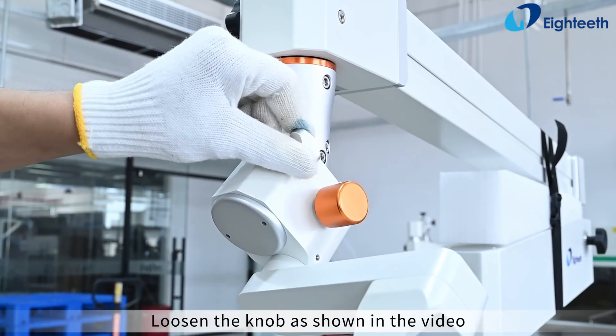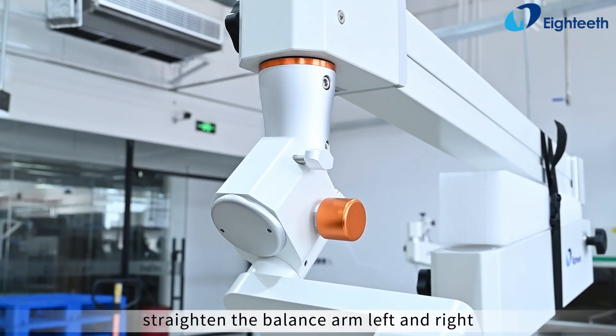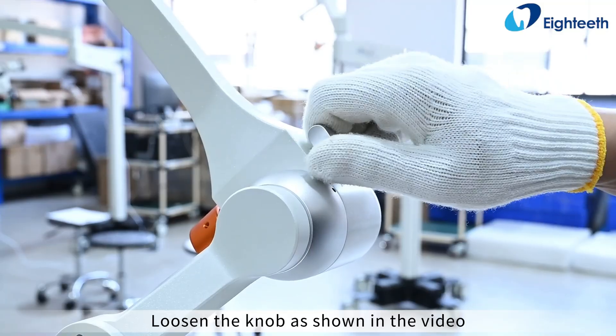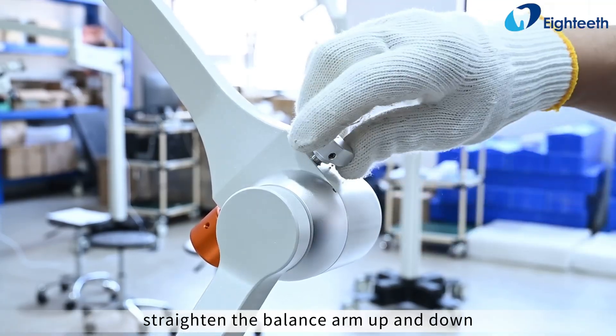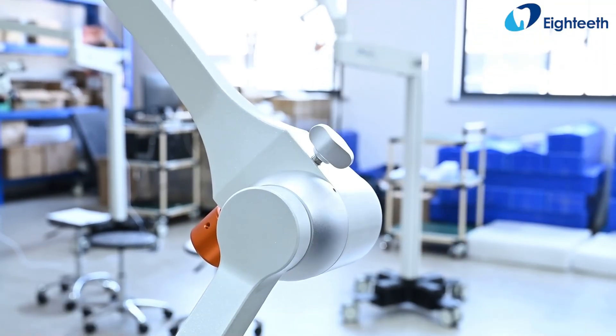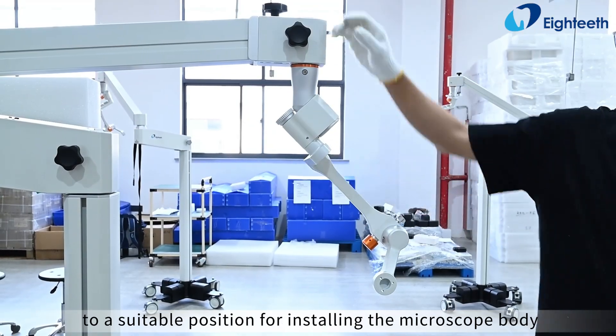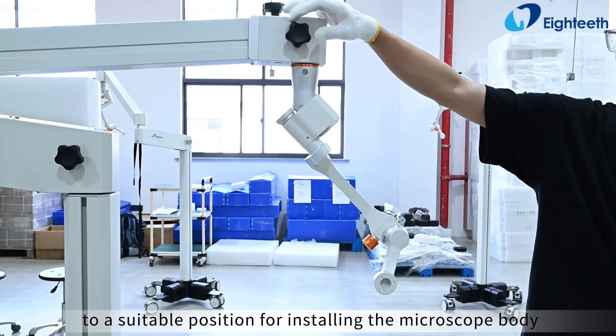Loosen the knob, straighten the balance arm left and right, then tighten the knob. Loosen the knob, straighten the balance arm up and down, then tighten the knob. Loosen the knob and straighten the entire balance arm to a suitable position for installing the microscope body.